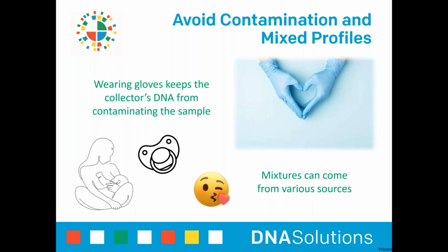Also be sure that samples from each tested party do not come in contact with each other. For example, if an alleged father and a child both provide a toothbrush for testing, be sure to package their toothbrushes separately from each other.